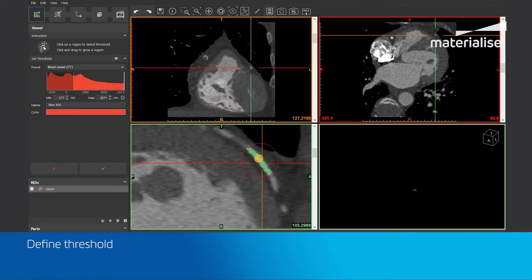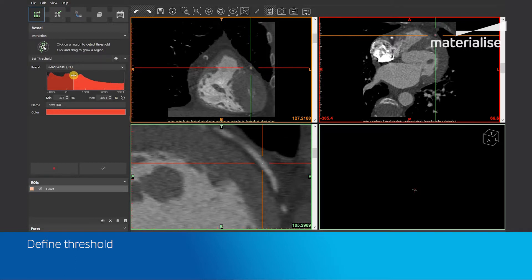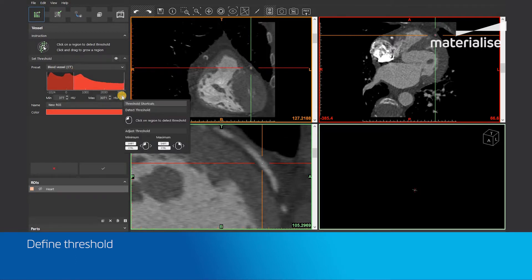The preview of the threshold range is shown in green on the images to review the defined threshold range. If you want to adjust the threshold manually, you can still use the presets, the histogram sliders, or the shortcut.